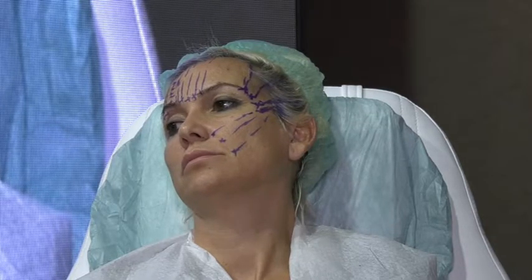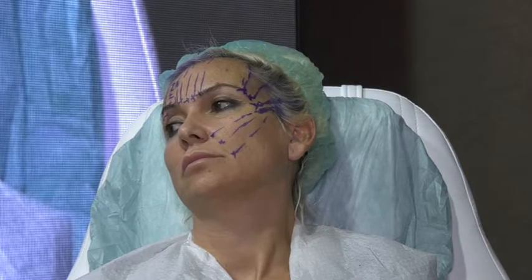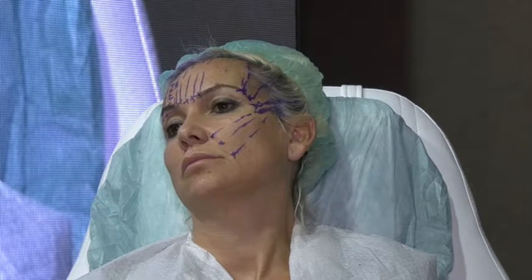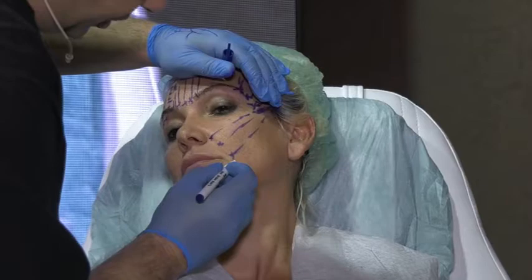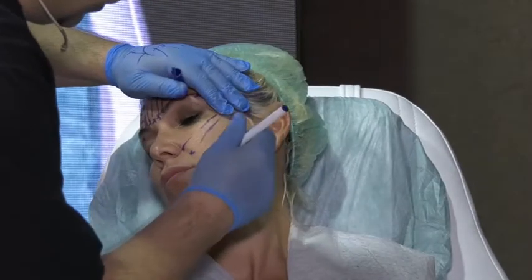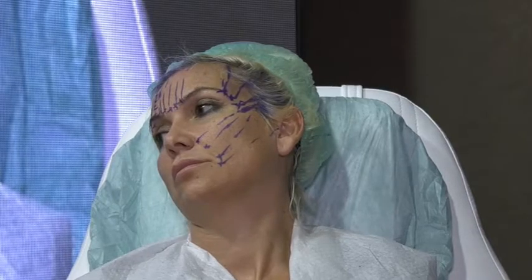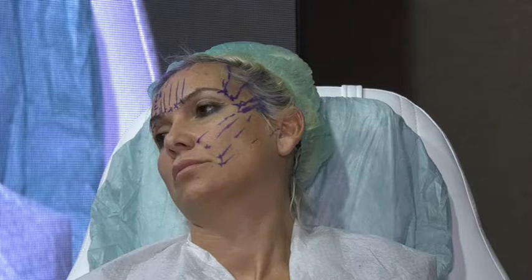The anatomy: when some patient comes to you and tells you, I want to do the jawline, she's telling you, please do the jawline for me like that. What is she telling? I want that. That's what you want. So we take the marionette to the tragus. The marionette goes to the tragus. So just above the marionette, go to the tragus. Okay, now I have no anatomical landmarks to create my entry points. So what should I do? I should create my landmark.